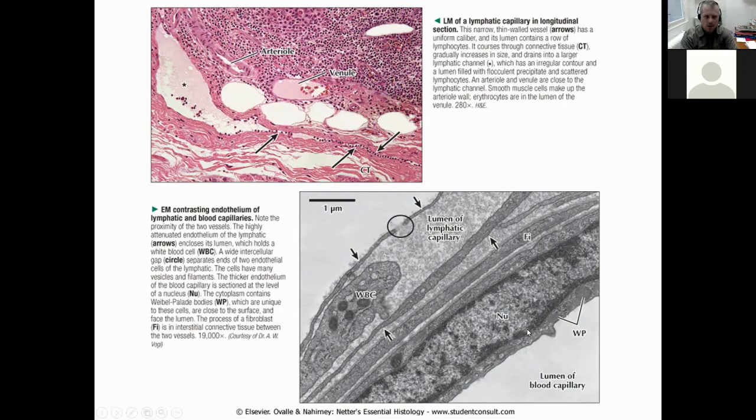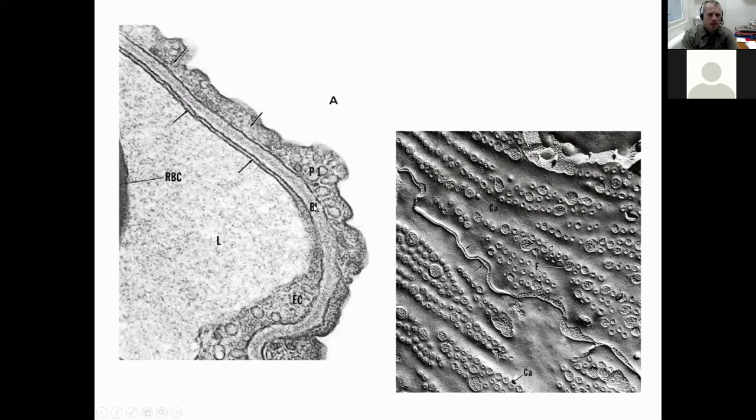And again, I just wanted to show you some special capillaries, like the capillaries of the lungs. This is the blood in a capillary running through the interalveolar septum in the lungs, and this is the air in the lung alveoli. So we definitely need the continuous type of capillaries here, because otherwise the blood plasma would escape into the lung alveoli and we would literally drown in our own tissue fluid. That's something we definitely don't want. So we have this continuous type of endothelium, continuous basal lamina, and type 1 pneumocytes, which are flat cells. So that's the blood-air barrier.